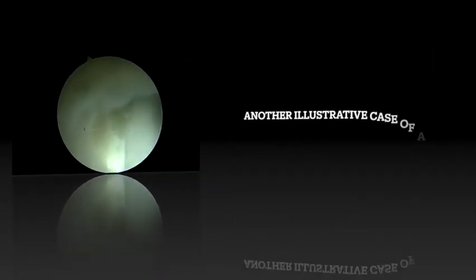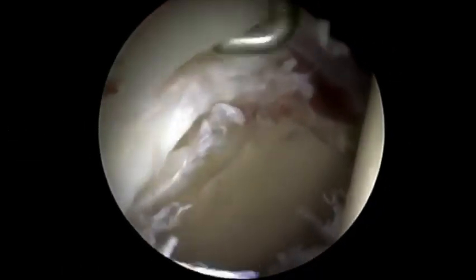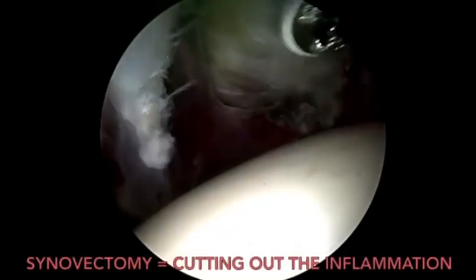We also demonstrate another illustrative case of an arthroscopic I&D of a septic hip, when at time of diagnostic arthroscopy a labral tear is found. Given the infectious nature of a septic hip, using anchors and suture materials is avoided to prevent a nidus for reinfection. After debridement and synovectomy, a radiofrequency ablator is used to heat stabilize the torn labrum without destabilizing the labral integrity.